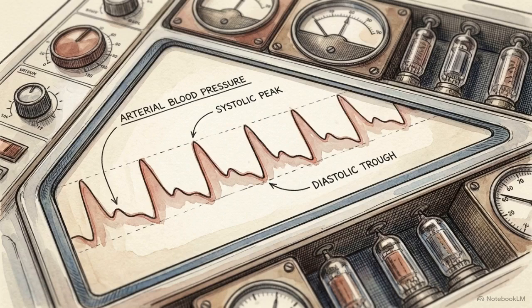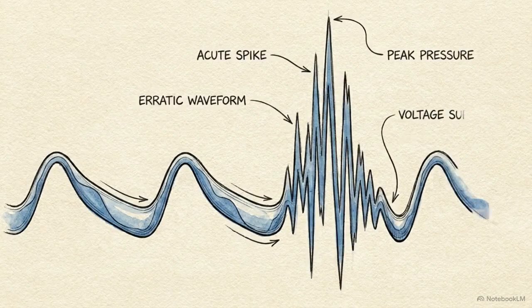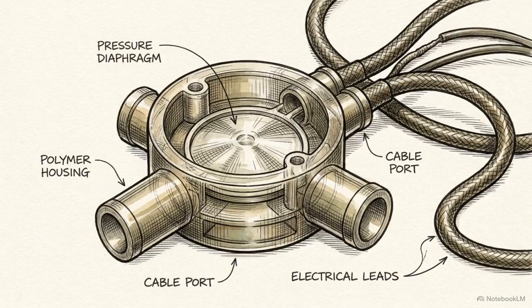In intensive care, a clean, accurate, invasive arterial blood pressure trace is a physiological lifeline, but that lifeline can lie. If the trace violently spikes, the monitor will display an artificially high systolic pressure. We assume the screen acts as a direct window into the patient's artery. It doesn't. The waveform is a heavily manipulated electrical output, and it is remarkably easy to distort.